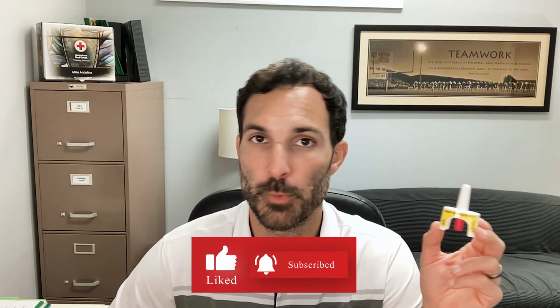Again, I would highly recommend you take that course if you're in a high-risk type of job or maybe workplace or maybe setting that you're constantly around, to make sure that we can help respond when we recognize opioid overdose, to help reverse the effects of opioids, especially that they have on the brain. So we'll again use the intranasal for naloxone, otherwise known as Narcan.